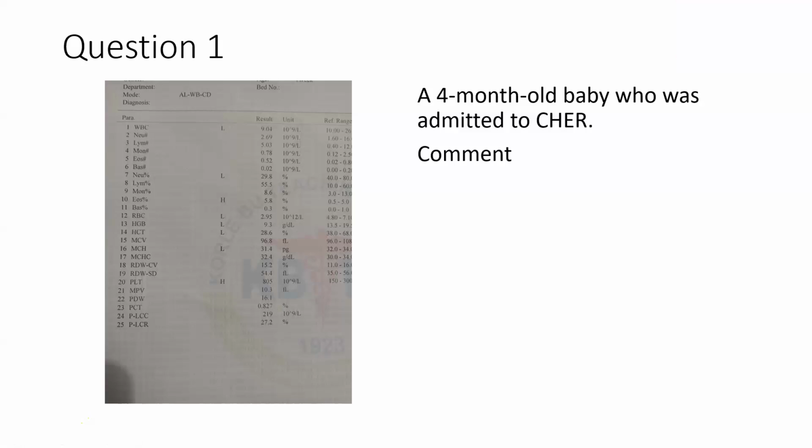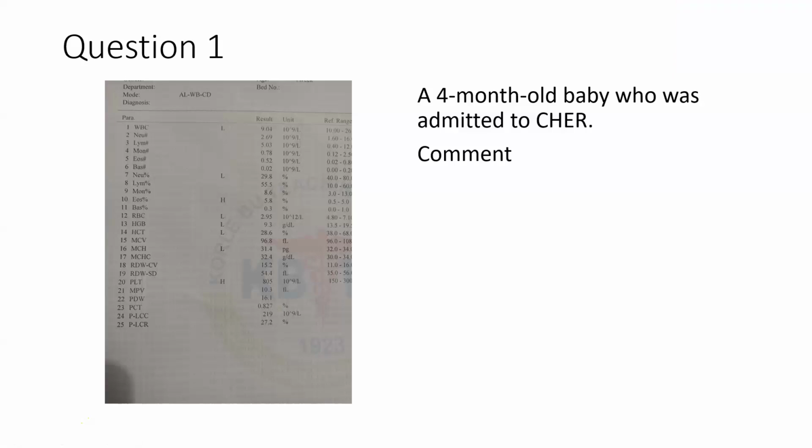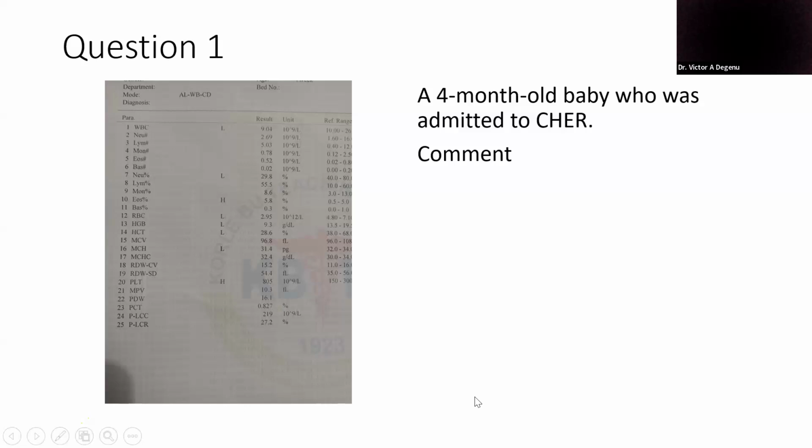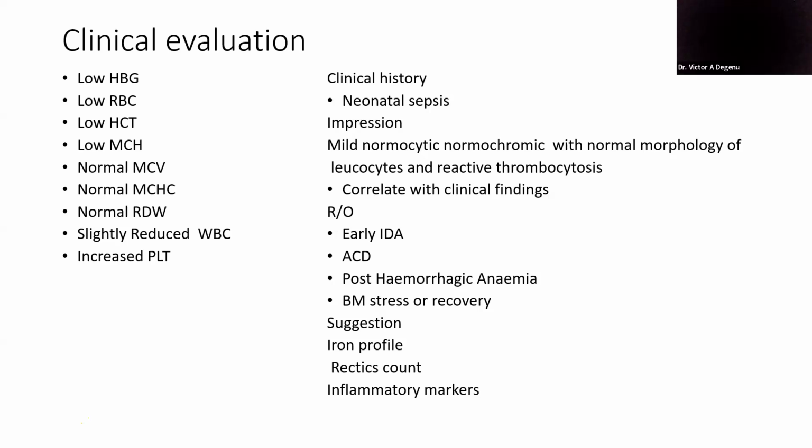Okay, I think you asked 3 questions. So the second question is the assumption of normocytic normochromic anemia. Yes. Then you mentioned that it could be an early iron deficiency. Yes.